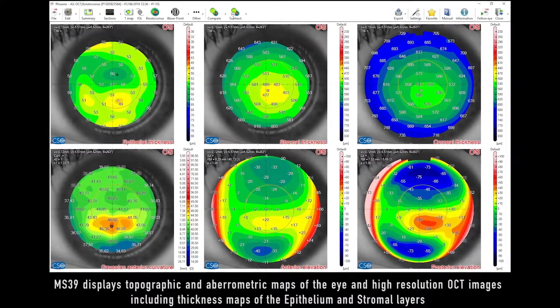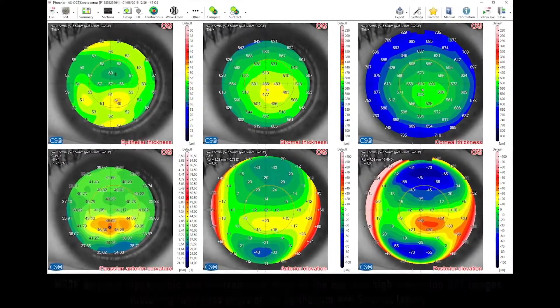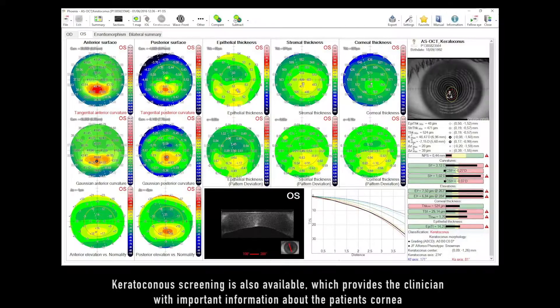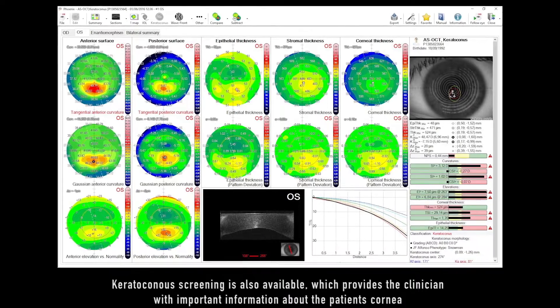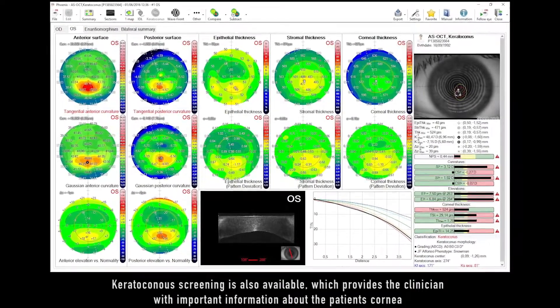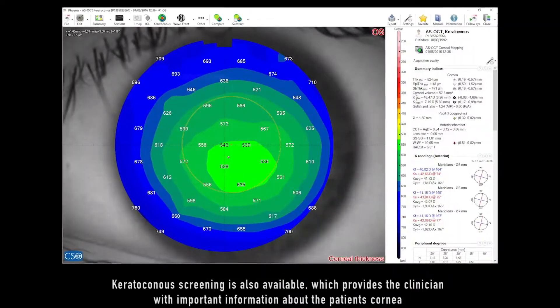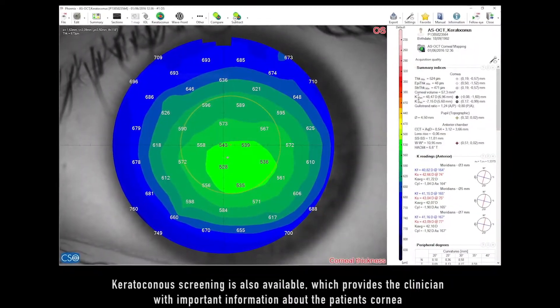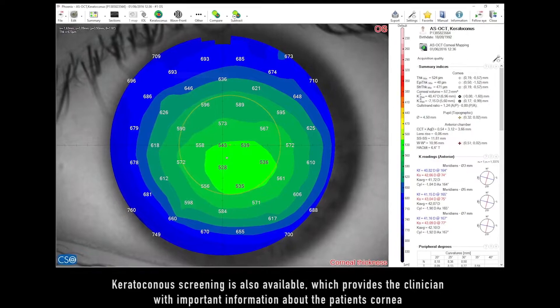MS-39 Keratoconus screening is also available, which provides the clinician with important information about the patient's cornea.